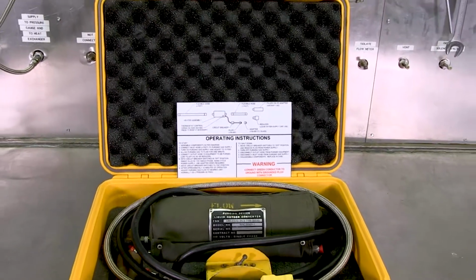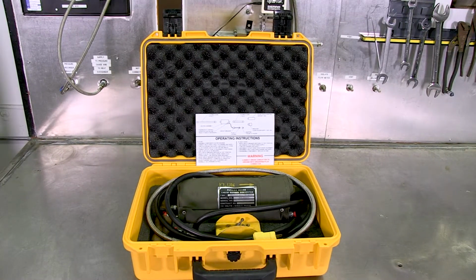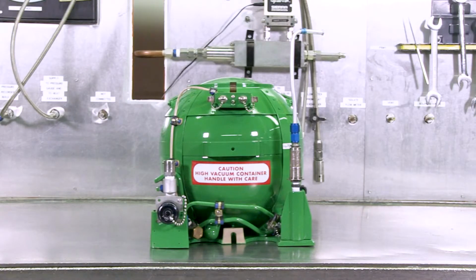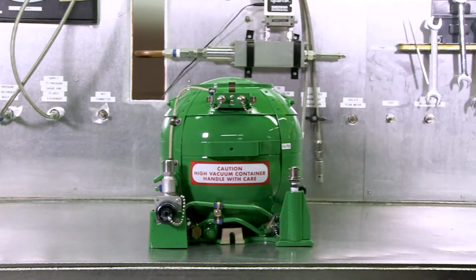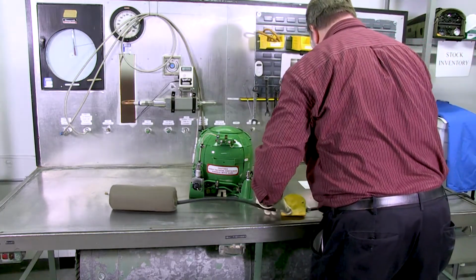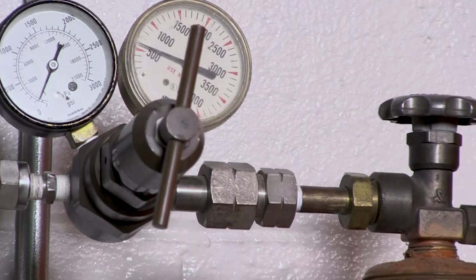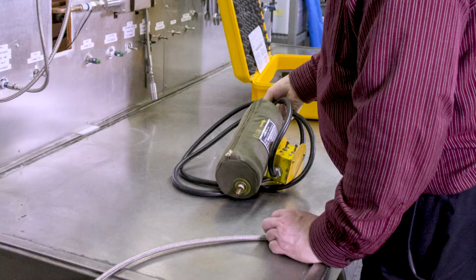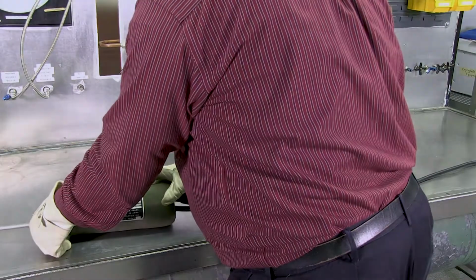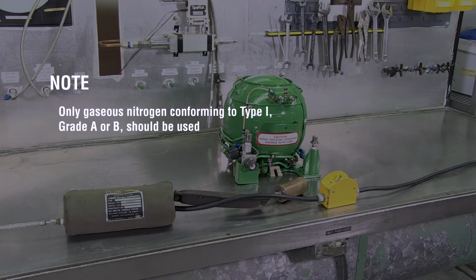To perform a hot-dry nitrogen purge procedure, you will need the items contained in the liquid oxygen converter system purge kit. When purging 7-liter or 10-liter converters, ascertain that the unit has been drained and completely emptied of LOX. With the unit and purge heater positioned on a clean work area, connect the approved nitrogen source equipped with a shutoff valve and regulator capable of controlling the supply pressure from 0 to 100 PSIG to the inlet of the purge heater. Note: only gaseous nitrogen conforming to Type 1, Grade A or B should be used as a source for purging.